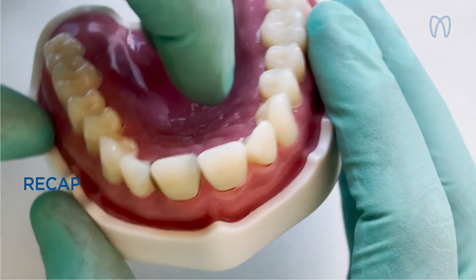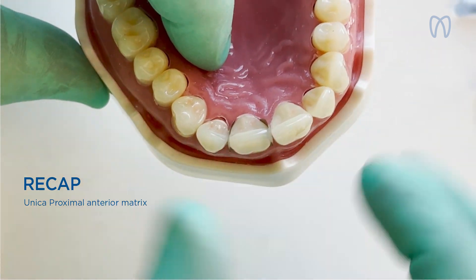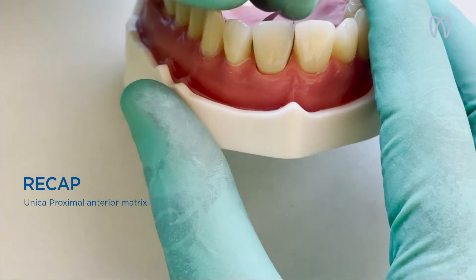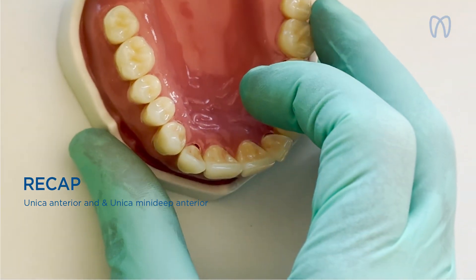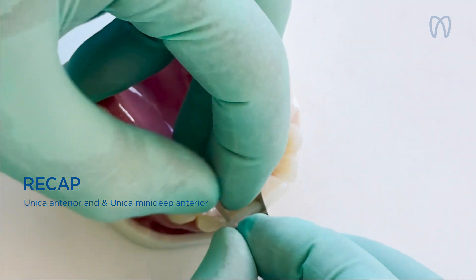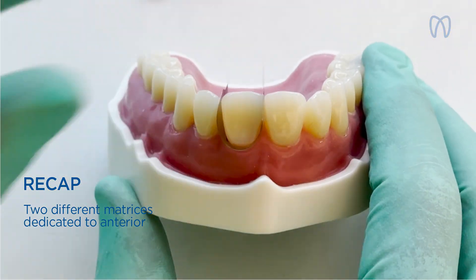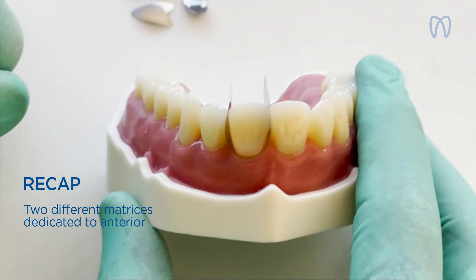To recap: when you want to restore only the interproximal areas, the sectorial matrix is ideal, giving you full vision all around. When instead you want to embrace the tooth totally, the UNICA matrix is the perfect one — place it, thanks to its shape, and pull it. These are two different kinds of matrix dedicated exclusively to anterior use by Polydentia, thanks to the Stale Italiano project.